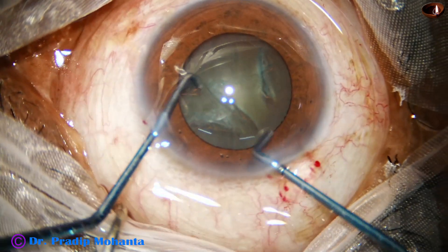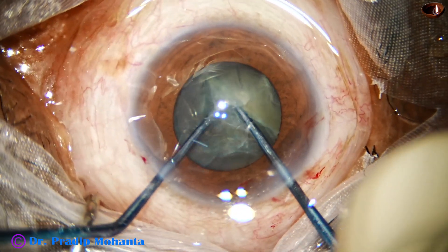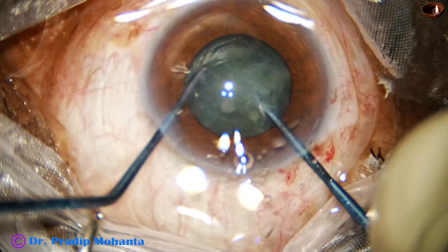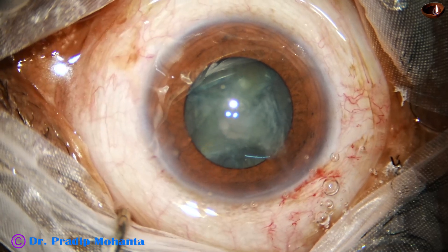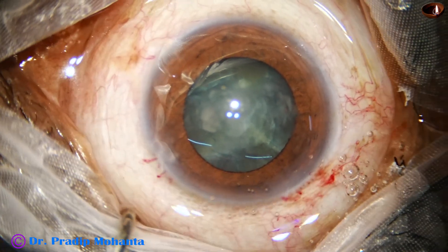And now this is the pre-chopper designed by me. Divided into two hemi nuclei. Rotated. Divide one hemi nucleus. Rotated and then divided the other hemi nucleus. In just a few seconds we have got four fragments.